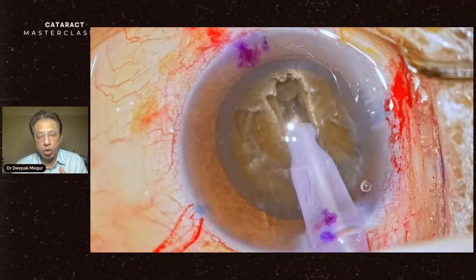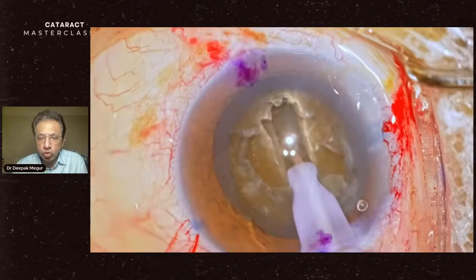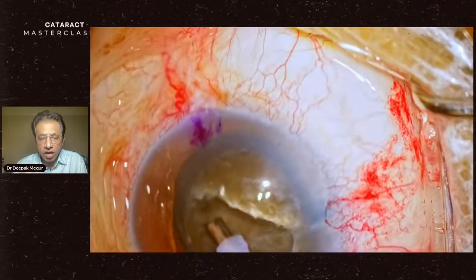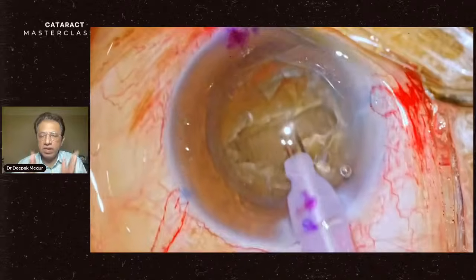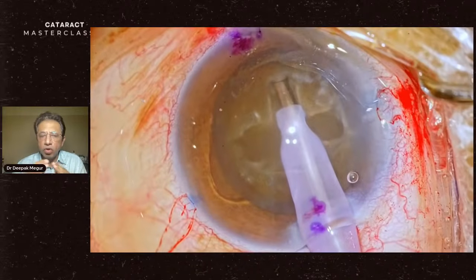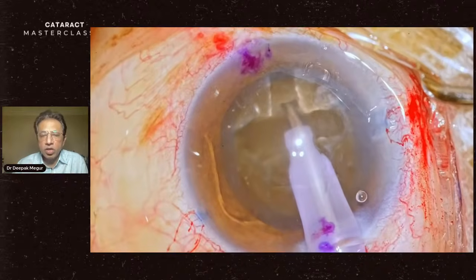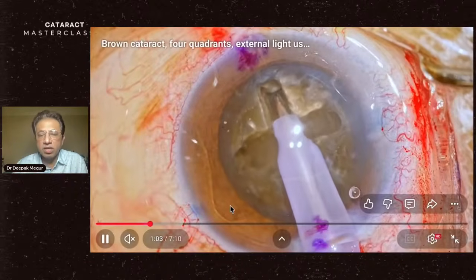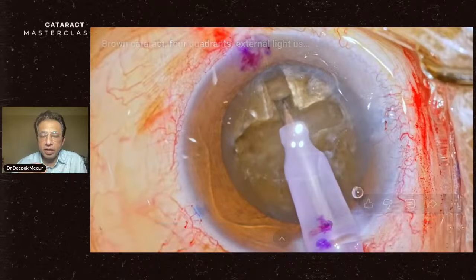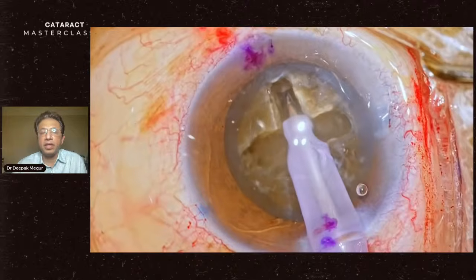In an atraumatic way. When you're doing this sculpting, the nucleus should not be shooed around, should not be pushed. It should just be the ultrasound energy shaving across. It should be effortless. We would want a slightly bigger, longer trench as well, so having a larger rhexis does help. Now this rhexis is about 5.5 millimeter. Look at it. The energy should cut through the nucleus, not any mechanical force.